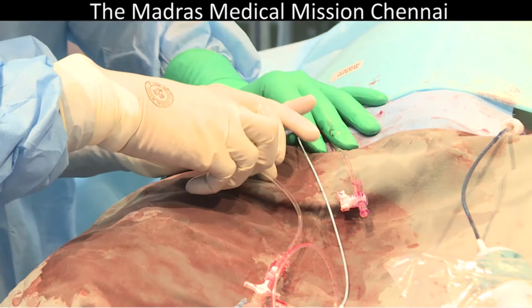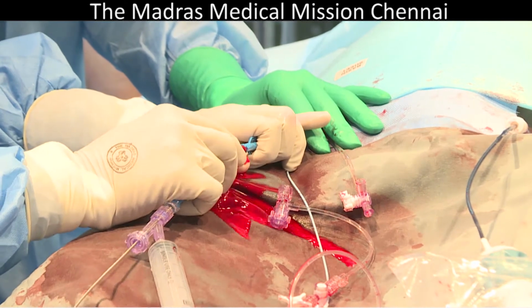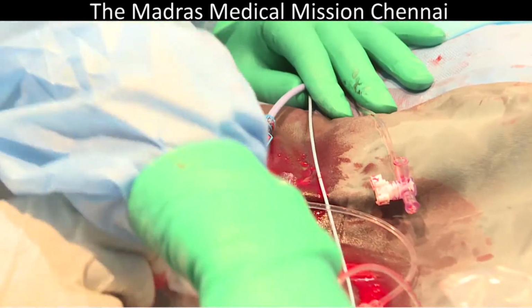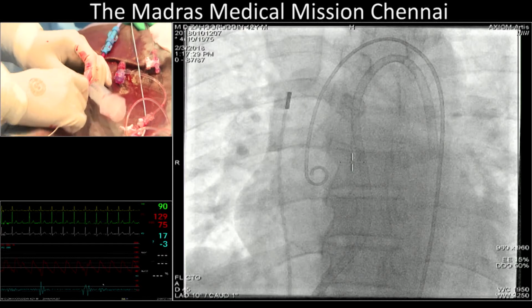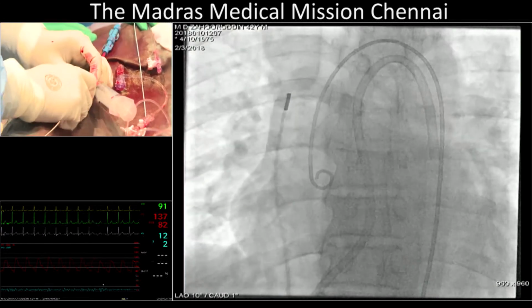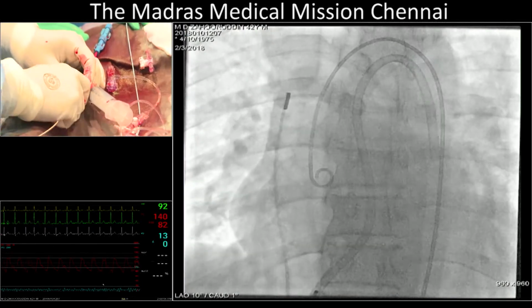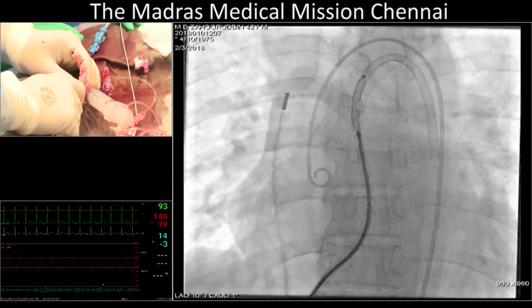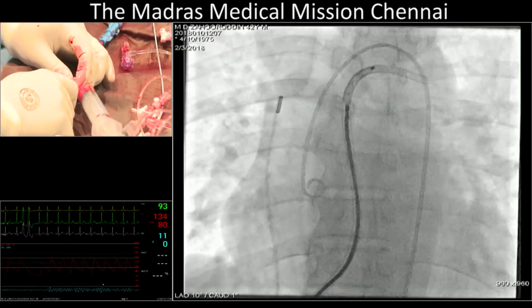12. Okay. So we are not intending to oversize enormously, but the aortic retention skirt is quite large. So you have a waist of 12. That means in total on the aortic side, 20 millimeters. Yes, 4 millimeter on the aortic side and 2 millimeter on the pulmonary side. Okay. So now we are bringing back the device.